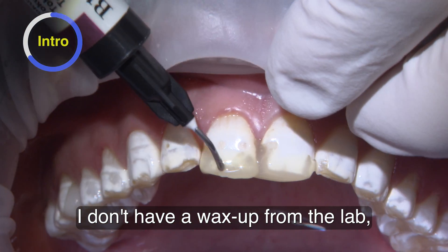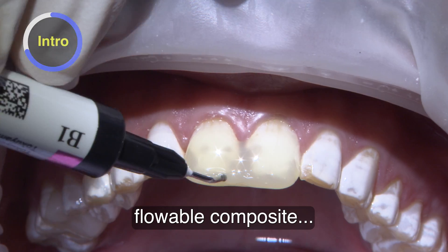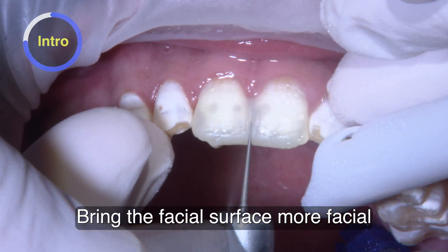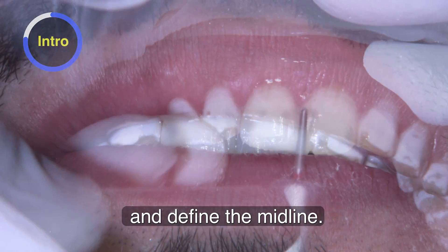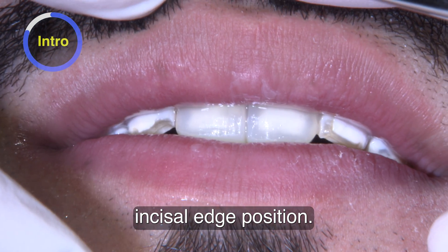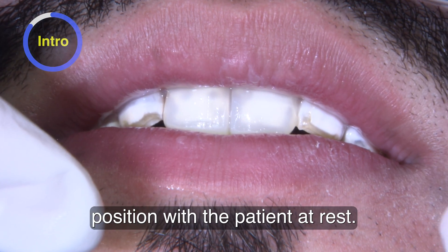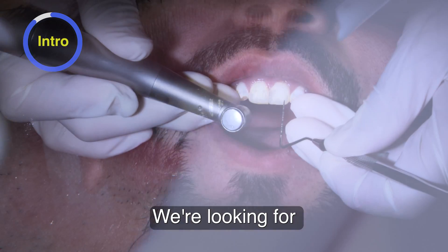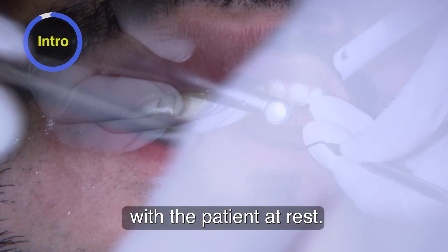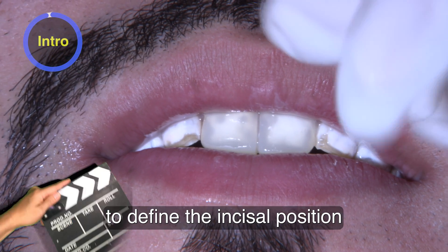I don't have a wax-up from the lab, so what I do is a chairside mock-up with flowable composite and build the incisal, bring the facial surface more facial, and define the midline. Once I have the midline incisal edge position, I evaluate it with the patient at rest — we're looking for two to three millimeters of incisal display at rest. That's usually what I use to define the incisal position for the patient.